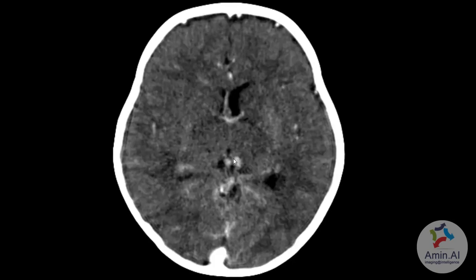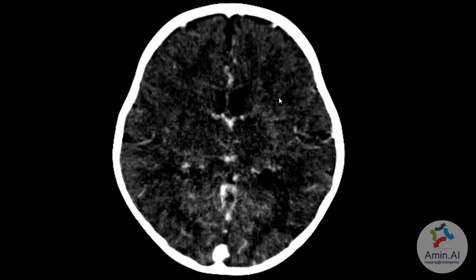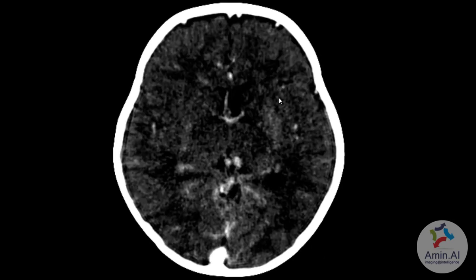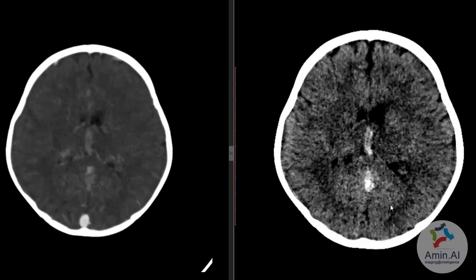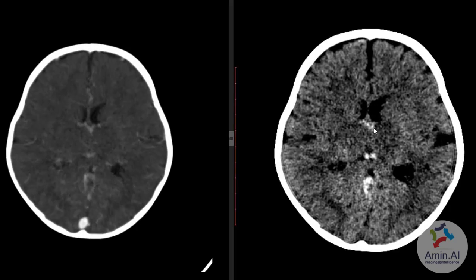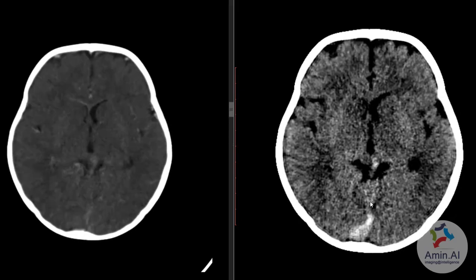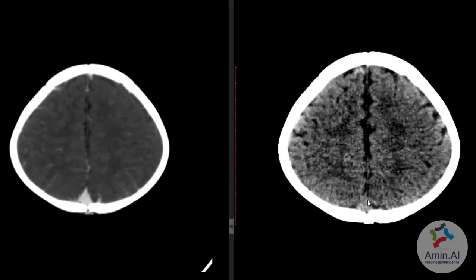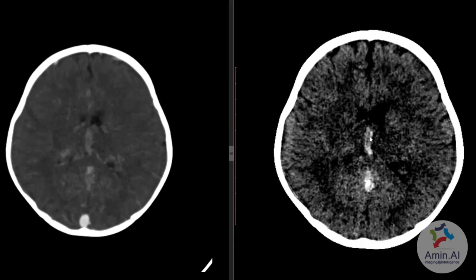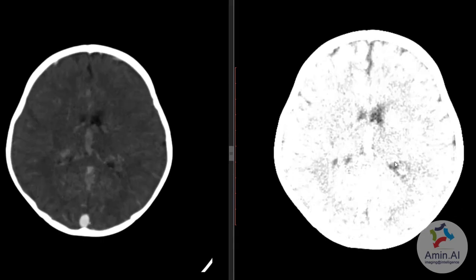When you saw the post-contrast image, there was some issue in that these are still hyperdense, but this hyperdensity is basically not due to contrast filling. Comparing the hyperdensities of the internal cerebral veins, the vein of Galen, and the straight sinus with the superior sagittal sinus, there is significant increased hyperdensity in this region.